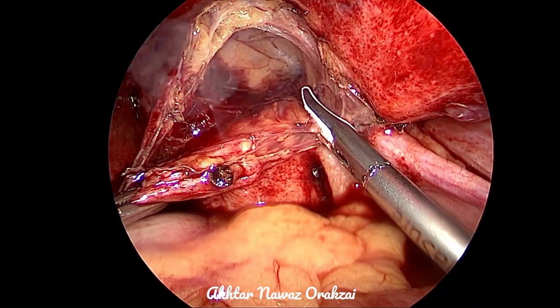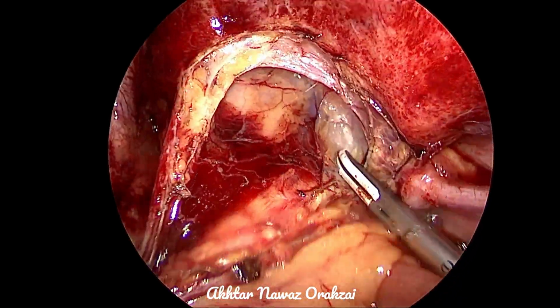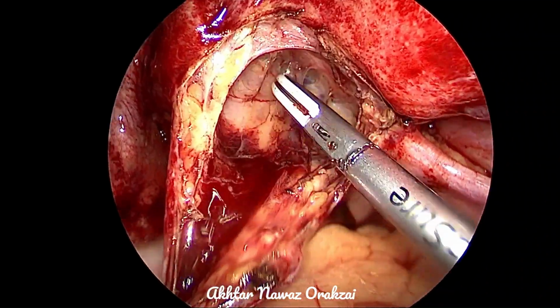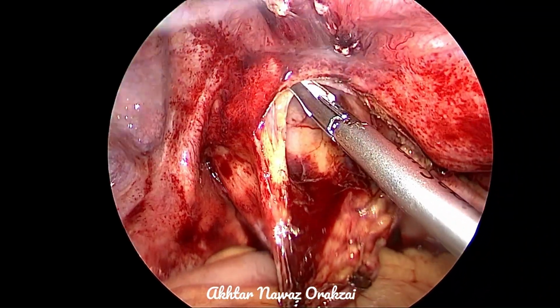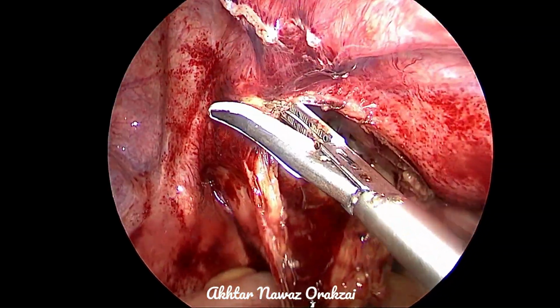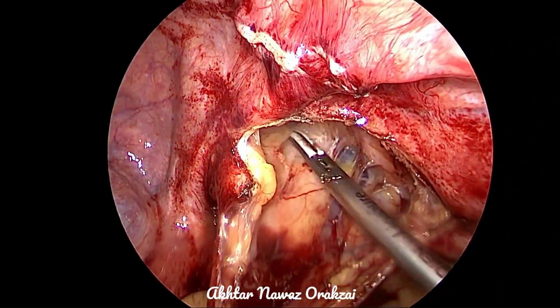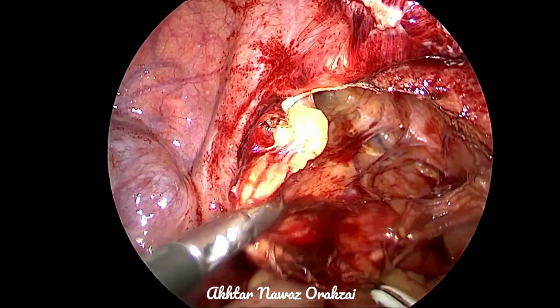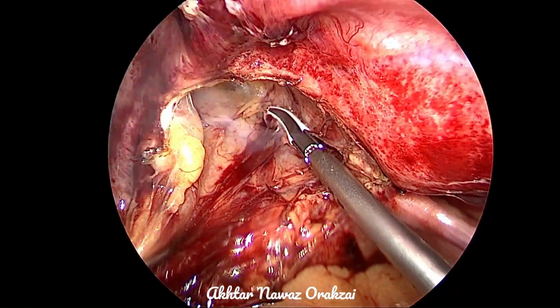Mobilization should be done as close to the anterior abdominal wall as possible, because if you do the dissection close to the bladder, there is a chance that the bladder will be opened. Nothing bad will happen if the bladder is opened. One can repair it, and in the majority of cases it can heal by itself. However, this will add to the morbidity.